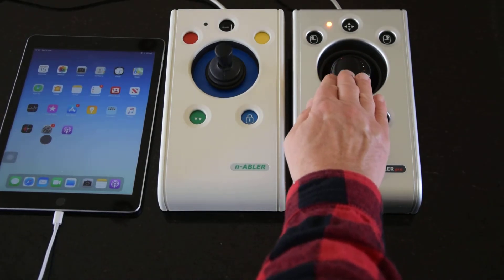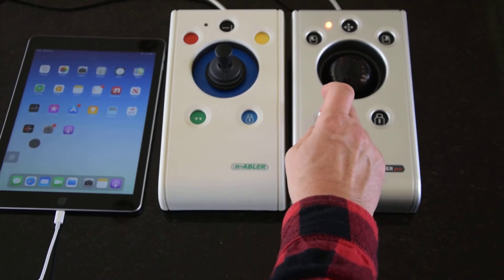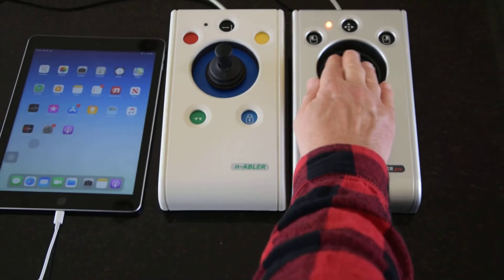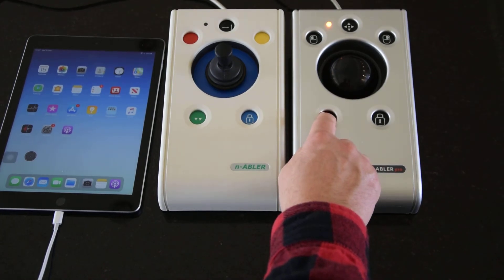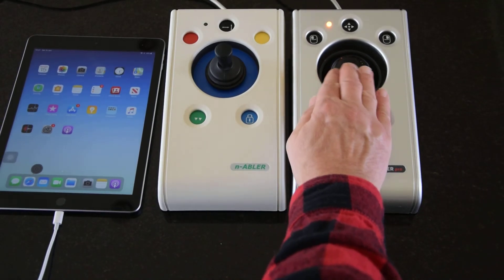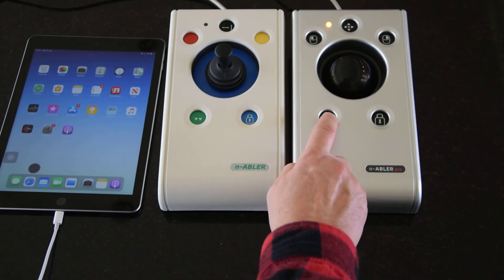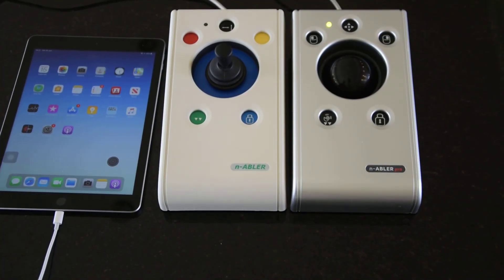With anti-tremor on, you have a much better chance of actually clicking on an app. There are actually three levels — go up a level and it's filtered out a bit more, and at the maximum level the tremor is taken out completely. A further press returns you to normal operation. Up next are the wireless products.